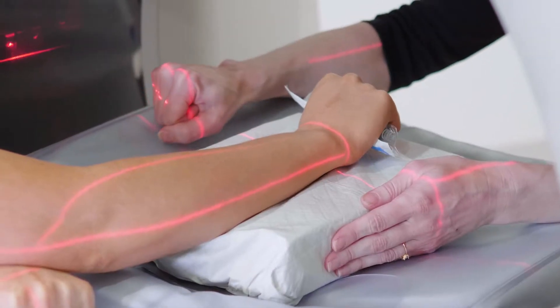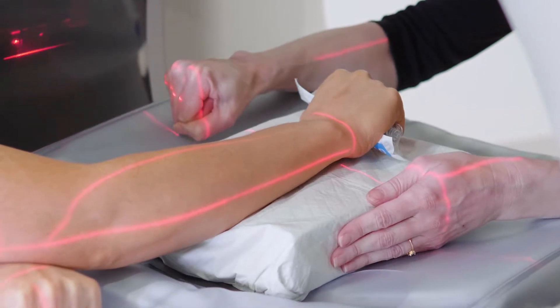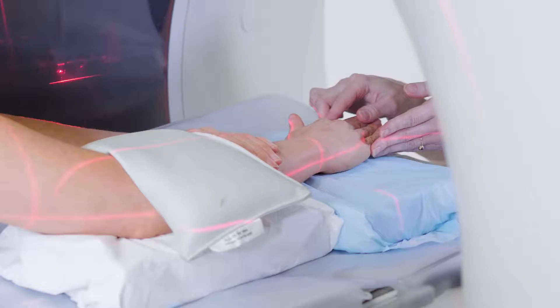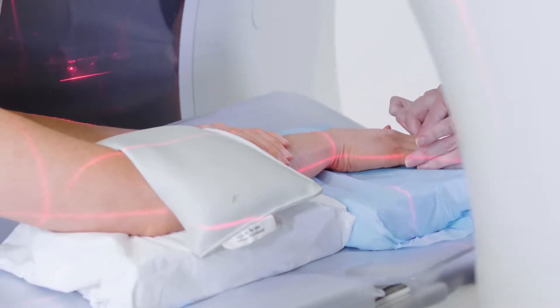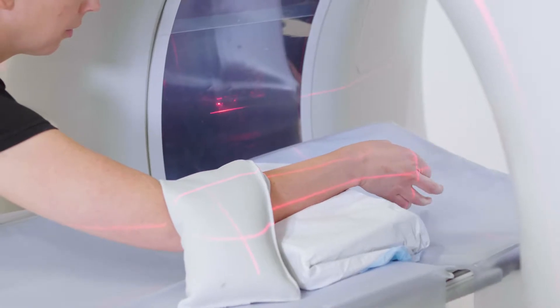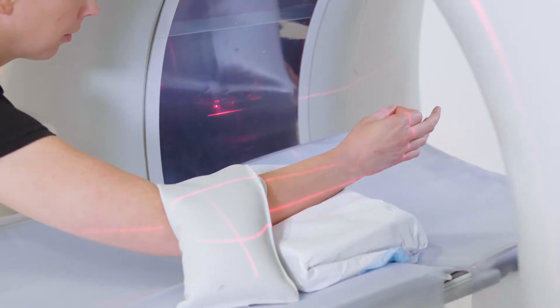One of the beauties of the Aquilion 1 and working in a team environment is that we actually take a history from the patient and try to work out what particular movement is causing their symptoms. As well as performing the standard static high-resolution imaging and going through our standard protocol of clenched fist, radial ulnar deviation, and dart thrower manoeuvre, we also get the patient to reproduce the specific manoeuvre which is causing their symptoms.